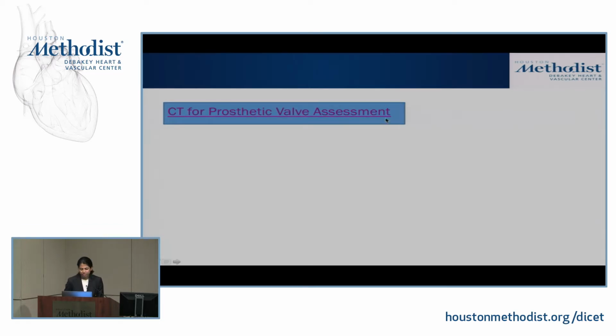Thank you. The other issue with this patient is a choice of prosthesis for the second operation. Many of these people have done well for 8 or 10 years with their mechanical valve, which was put in appropriately because they're in their 50s. And then we see them for a reoperation in their 60s, and some of them have a history. Her INR noted was 1.5 to 2. And if they've had problems with their Coumadin over the years, something to consider is using a bioprosthetic valve when they come back in their 60s.